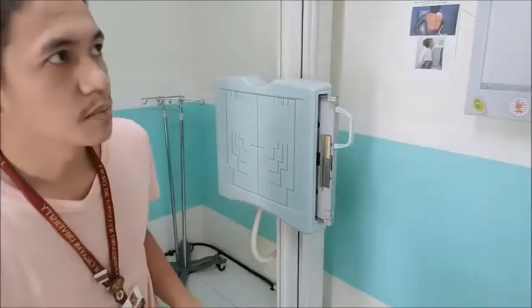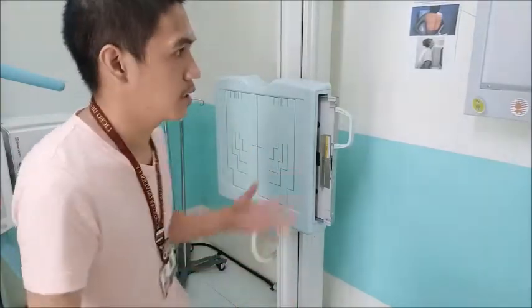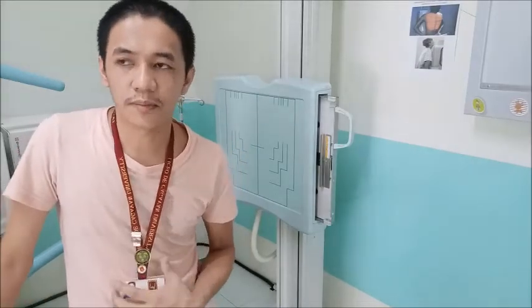Okay, so if your patient is pediatric, 5 years old or below, and the companion is his or her mother, and the mother is pregnant, what to do? You can call an orderly or the wardman of the hospital. Orderly and wardman are just the same terminologies.